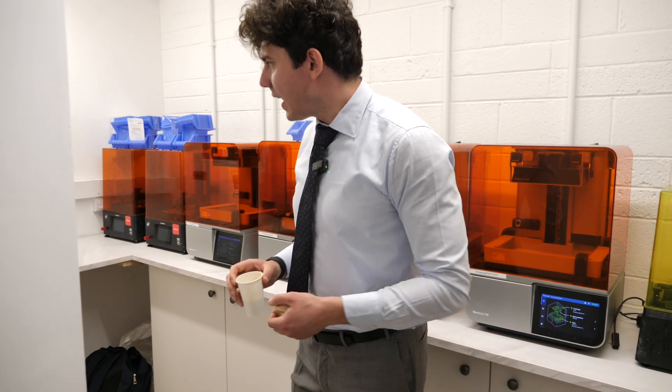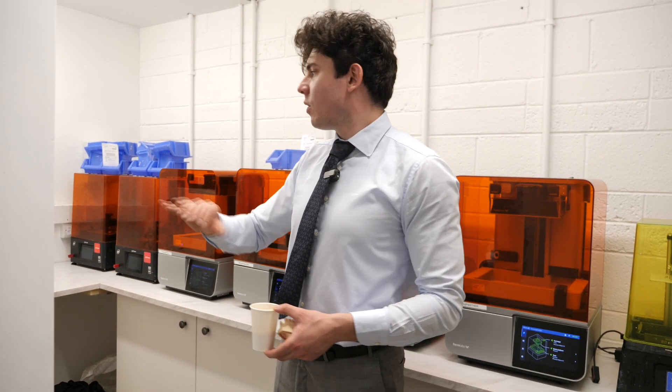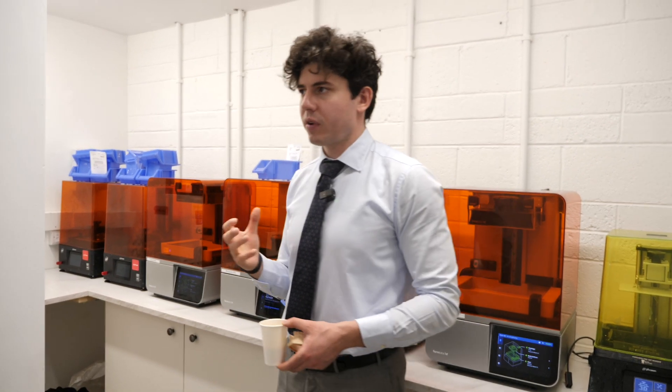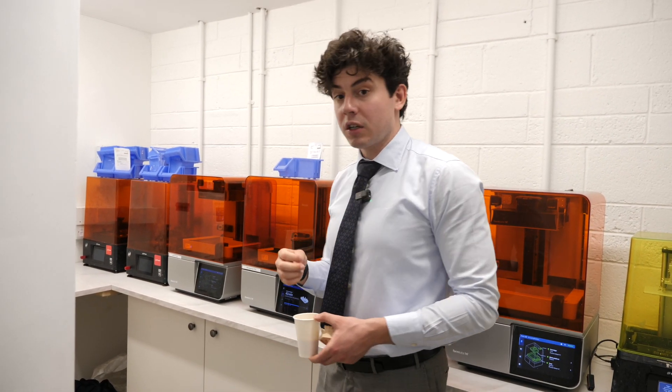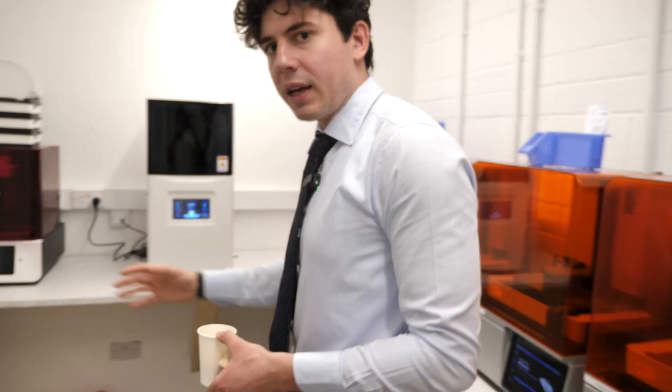We have different brands of 3D printers and we've bought almost every possible printer, iterated and tinkered with them. Some aren't here because they frankly didn't make the cut. I'll go through the different brands and the specs.